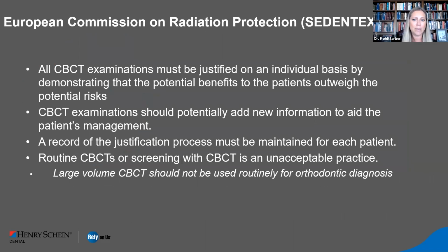So way back when we used to place these devices, and I have to say, I didn't always monitor them, but now the research is letting us know we should probably monitor those 6 months to a year afterwards, just to make sure that we're not causing more harm. Because clinically, it can take up to 3 years to see a clinical difference, and by that time, there's a lot of damage to the mandibular condyles.